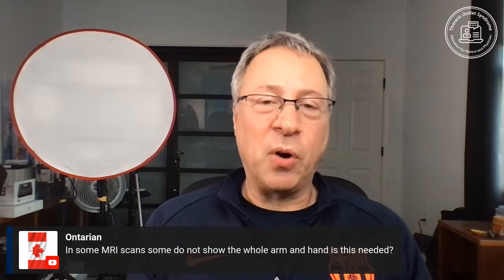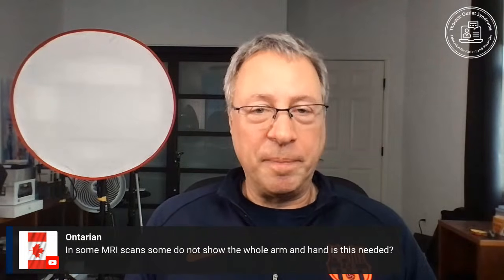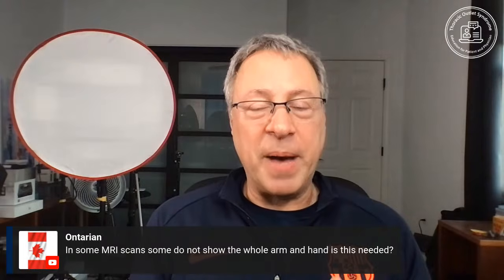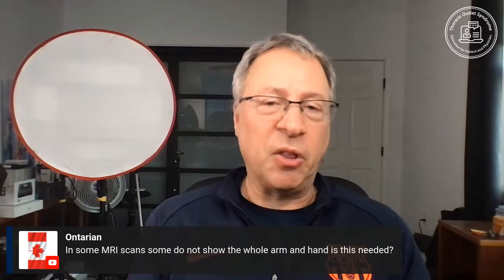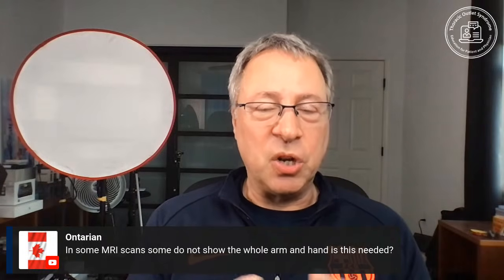So if we use an MRI with a large field of view, meaning that we take an image of an entire arm, we won't be able to see the fine detail that we need. If the patient has a large mass and we want to see the edges of the mass, we might do that. But in the thoracic outlet, where I specialize, we want to see some pretty small structures. So we don't include the entire head or the entire chest. We try to limit the area we view just to the region of interest, the cervical spine, the thoracic outlet, and just getting into the shoulder. I hope that answers your question.